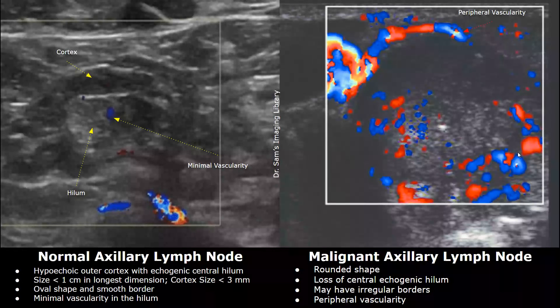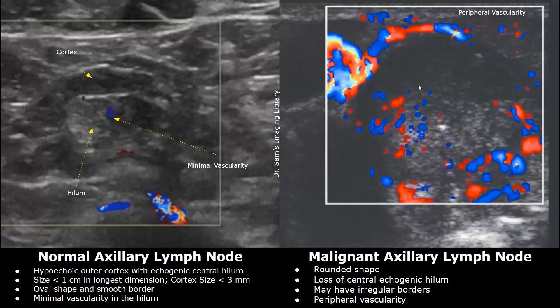On color Doppler, we will find peripheral vascularity in a malignant lymph node — we can see Doppler signals at the borders of the lymph node. The lymph node has a heterogeneous appearance, there is absence of a central echogenic hilum, and it also has a more rounded shape.